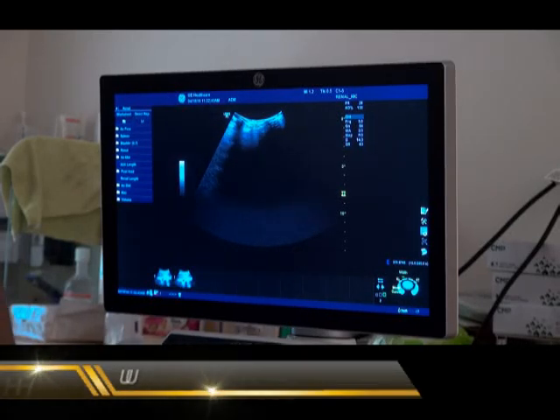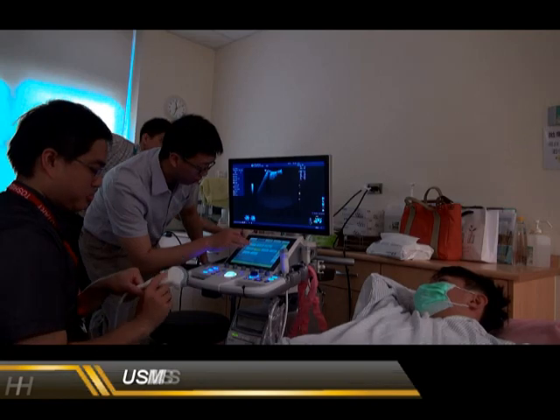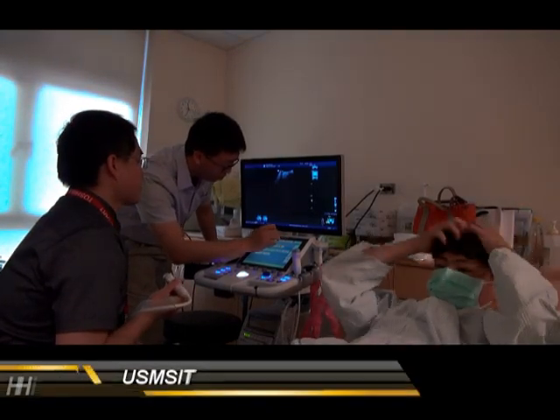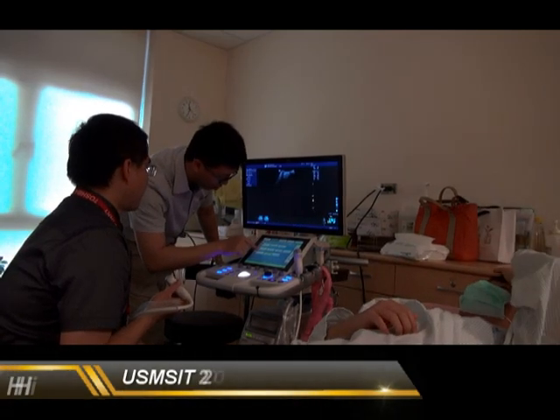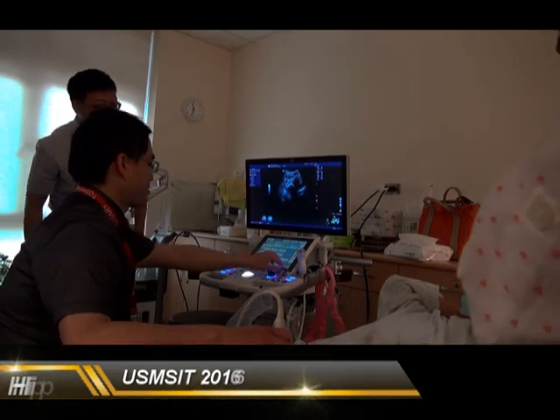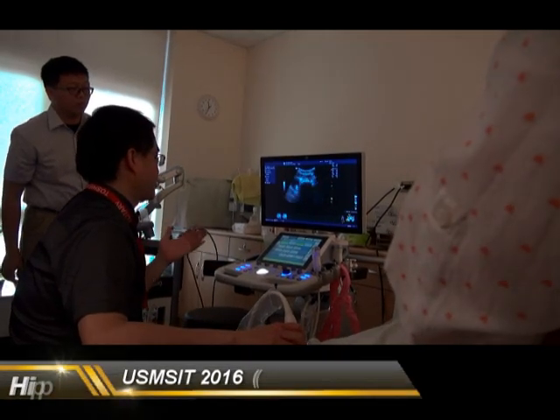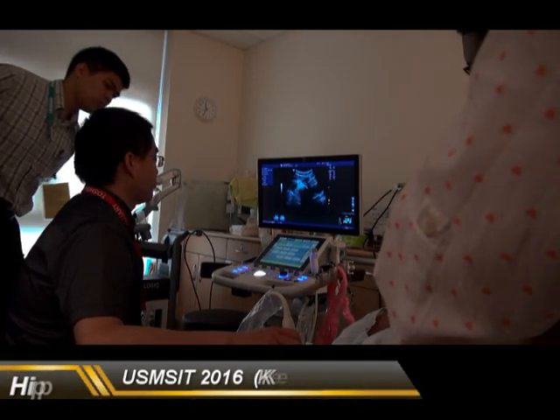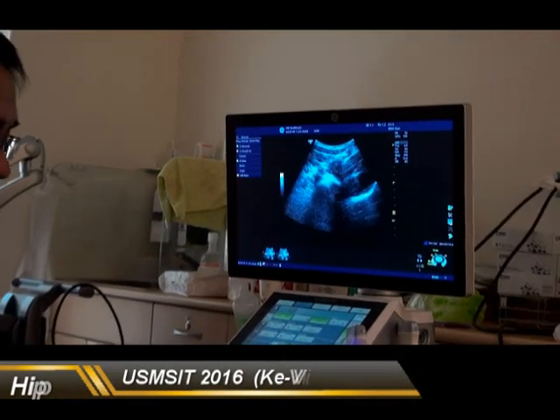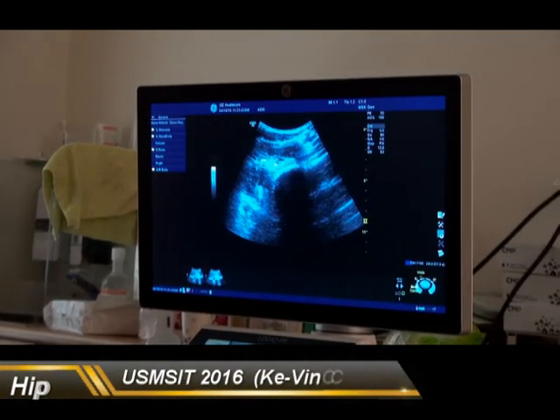First, let's talk about the anterior hip joint. This is the curve probe. When I put the probe, everything looks very unfamiliar because this is a curve probe. When we put our probe on the patient's hip, we have to recognize several important structures. First, at the anterior part, there are the iliopsoas muscle and sartorius.